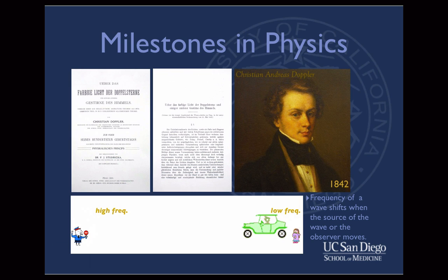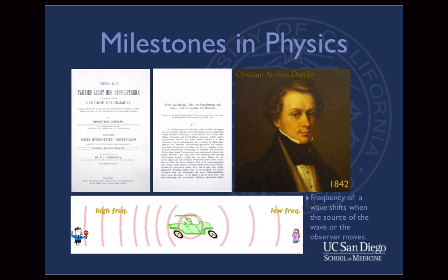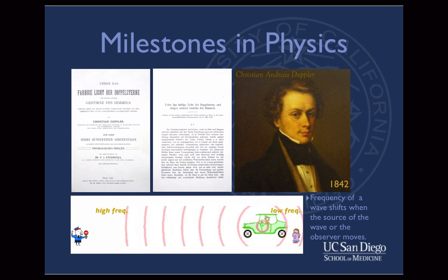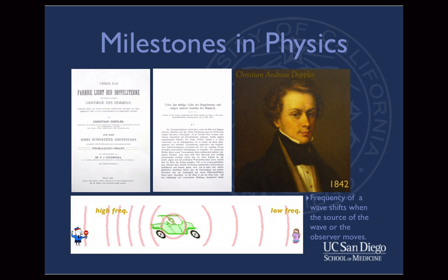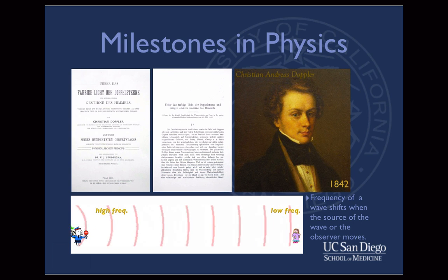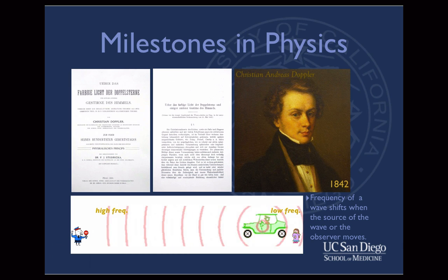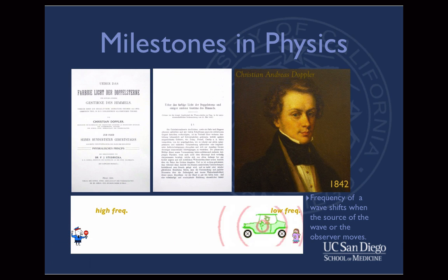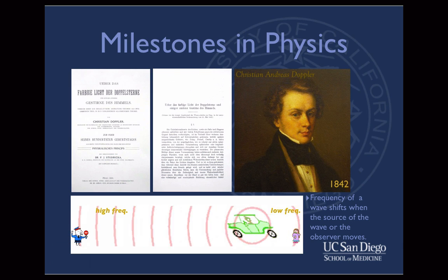As the car moves to the left of the screen, the observer on the left will experience a higher frequency sound wave. Meanwhile, the observer on the right will experience a lower frequency sound wave. The Doppler effect is used in modern ultrasound machines to analyze blood flow using different forms of Doppler imaging. This sound clip demonstrates a car emitting sound from its horn. Note that as the car passes by the listener, the frequency changes from high to low.